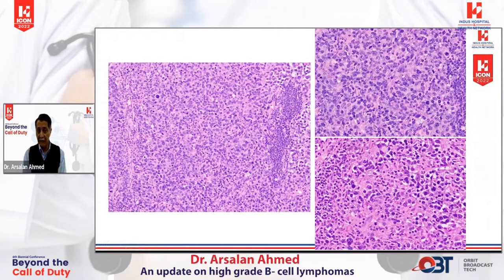So this looks like a large B-cell lymphoma, looks pleomorphic. So I'm going to follow the same steps. We did a CD5 and cyclin D1. They came out to be negative. So obviously I removed the blastoid and pleomorphic variant of mantle cell lymphoma out of the way. The next thing was, is it EBV? It was EBV negative. So I moved EBV out of the way also. So I was left with pleomorphic large B-cell lymphoma, mantle cell gone, EBV positive diffuse large B-cell lymphoma gone.